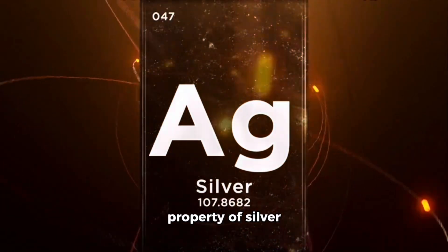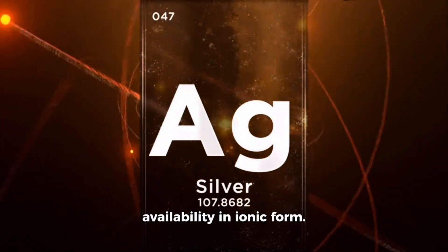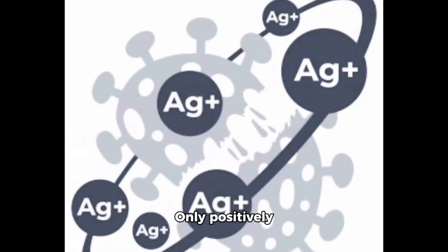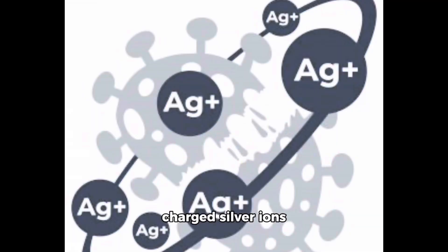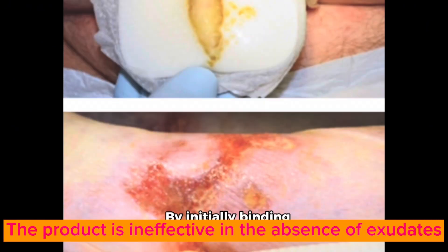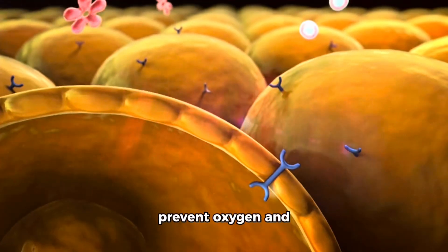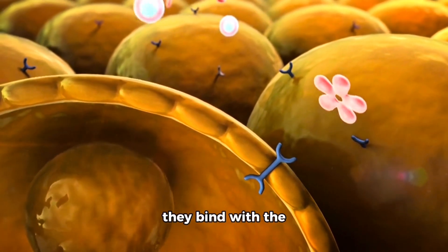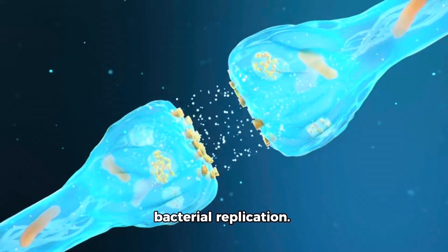The brown part of the dressing is the silver component of the product. The antimicrobial property of silver depends on its availability in ionic form. Elemental silver is non-reactive against bacteria and therefore would not exert a cytotoxic effect. Only positively charged silver ions, Ag+, are bactericidal. To become positively charged, silver must lose an electron. It can do so when exposed to an aqueous environment such as wound exudate. By initially binding to the bacterial cell wall, silver ions can prevent oxygen and nutrient transport into the bacterial cell. They then migrate inside the cell where they bind with the bacterial DNA and effectively inhibit bacterial replication.